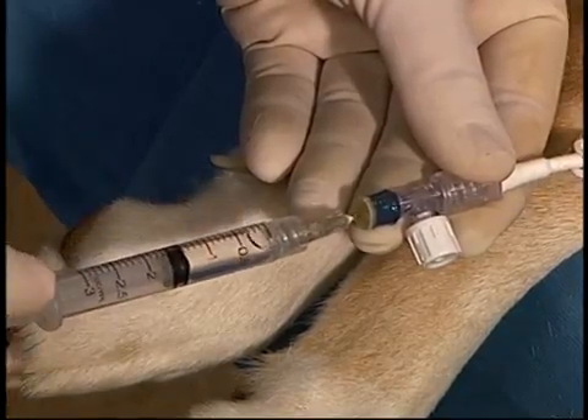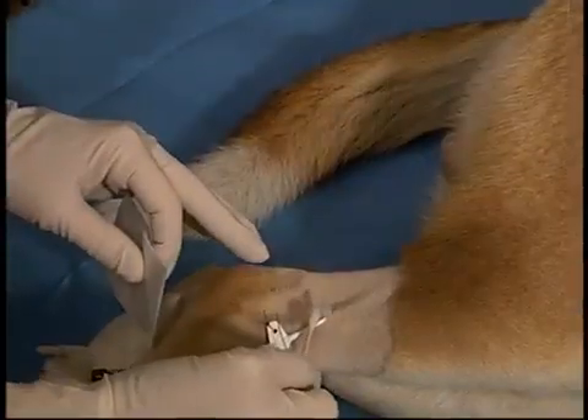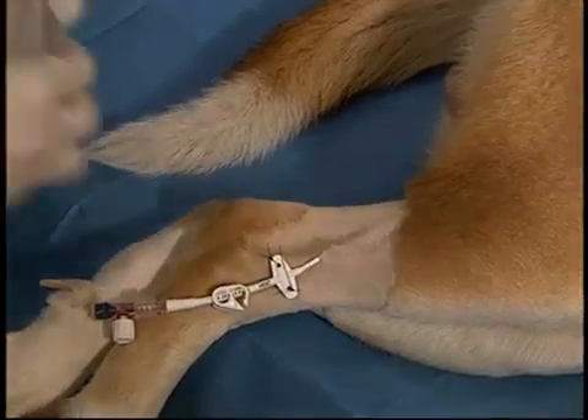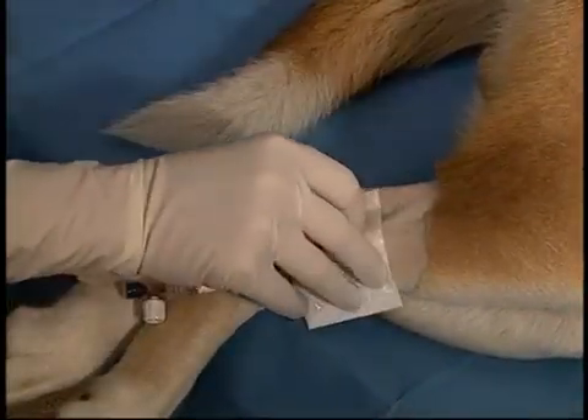There may be leakage from the end of the T-port. If this occurs, the T-port should be replaced or an extension added. The catheter is then bandaged. Broad-spectrum antibiotic is placed over the venotomy site, followed by a sterile telfa pad or 4x4s, and a light dressing is placed.